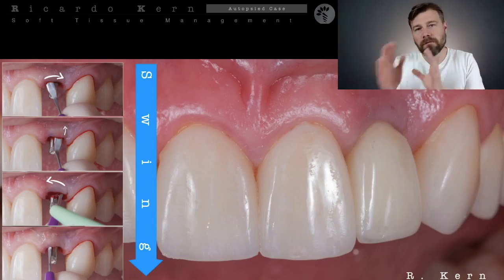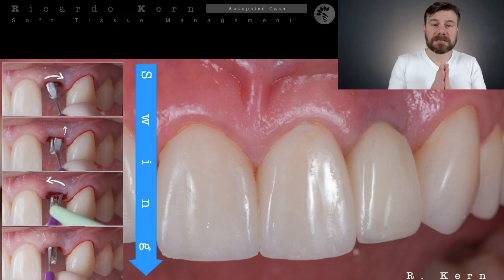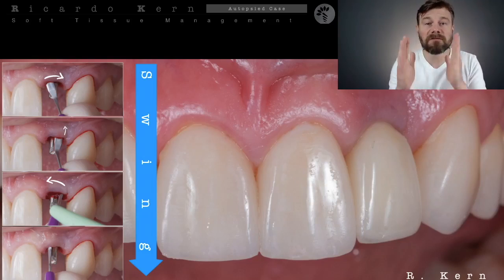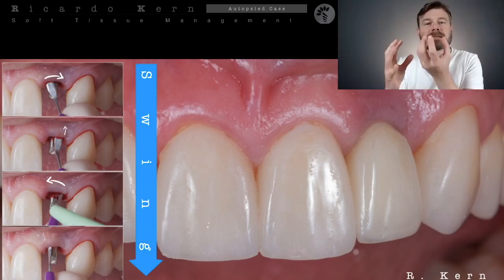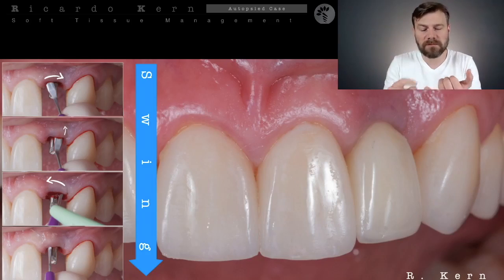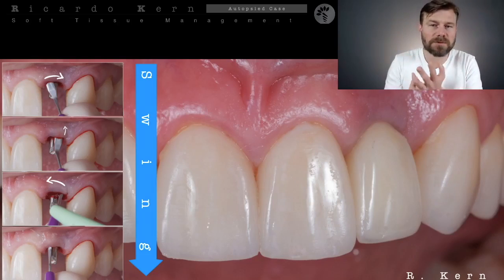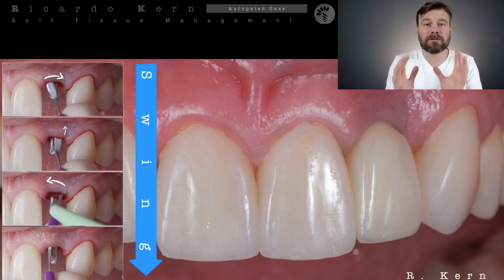What is for and what is against one of these options? Every time that you go to full thickness flap, you're going to leave more thickness on the flap. So when you go inside with your connective tissue, usually your flap is stronger and has more chance to survive because you preserve periosteum, all the blood flow, and all the tissue arranged and perfect to endure, okay?